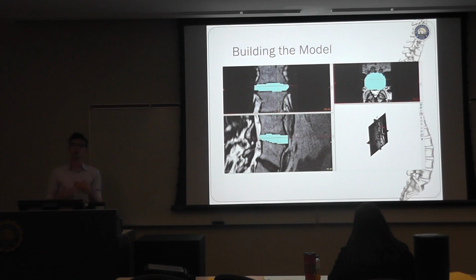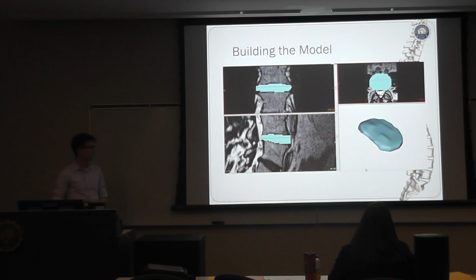Then you have to go through those ones as well because it'll probably have holes or weird little dips or crests, which are not really logical. So you go through everything slice by slice and make sure it's all logically uniform, at which point we can finally generate our model. So boom, it looks something like that.